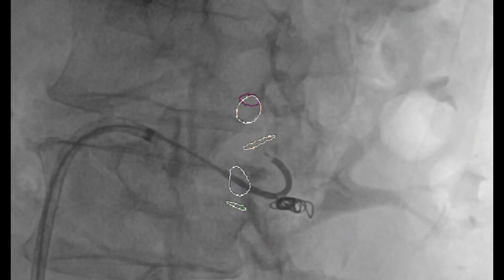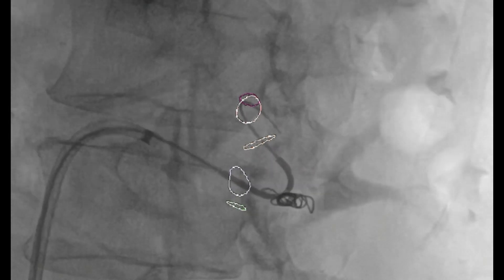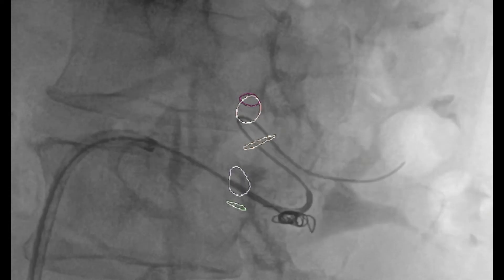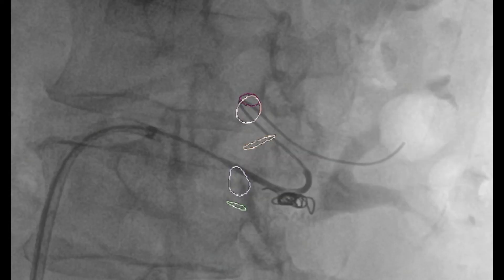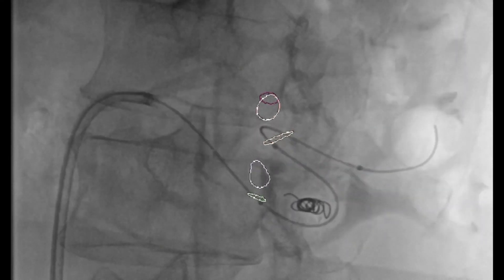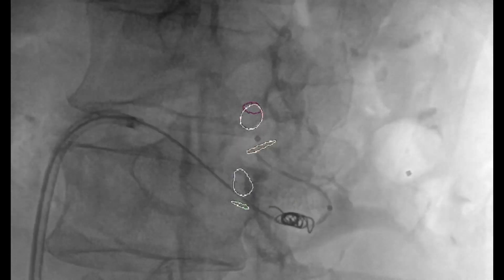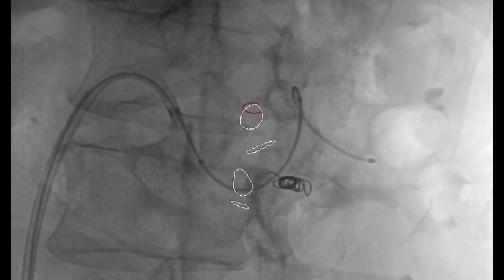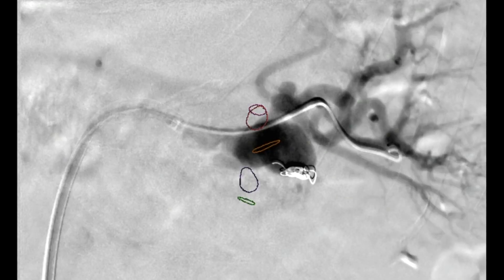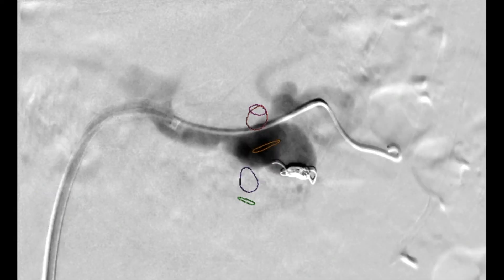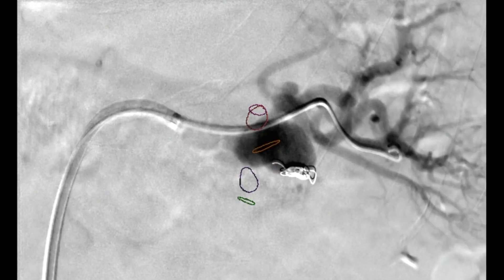A guidewire is then introduced into one of the branches supplying the upper two-thirds of the kidney. Once the wire is advanced, a quick-cross catheter is advanced over this wire, and the wire is exchanged for a Rosen wire. An angiogram is then performed, and we measured the diameter and length of the stent to be used.